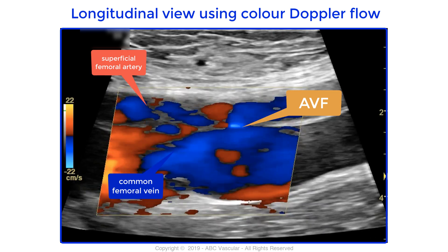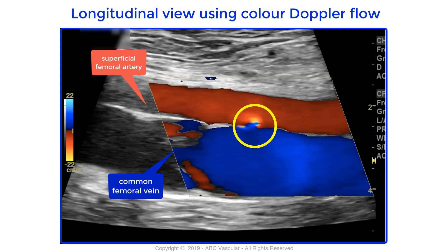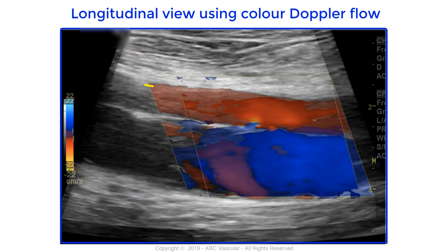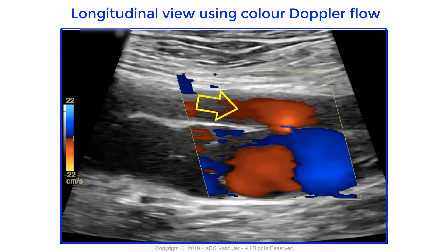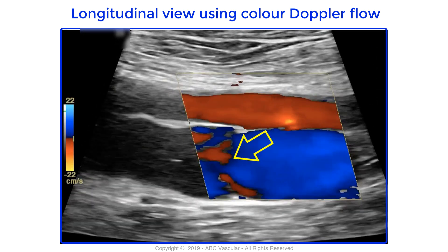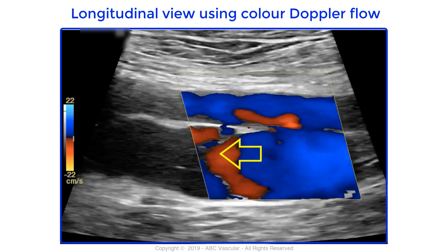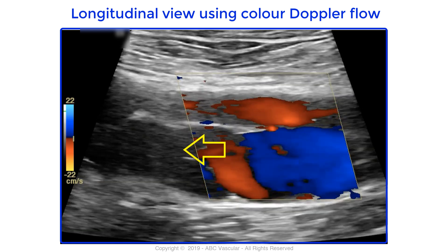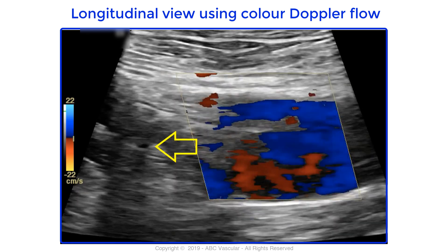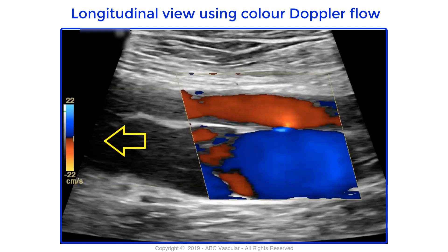The arteriovenous fistula is detected using color Doppler flow by the presence of color Doppler aliasing at this level. Flow enters from the superficial femoral artery into the common femoral vein via the fistula, therefore increasing the speed of flow within the common femoral vein, which becomes turbulent.